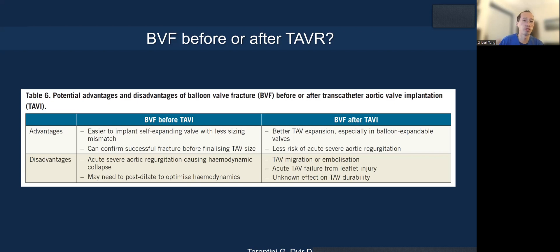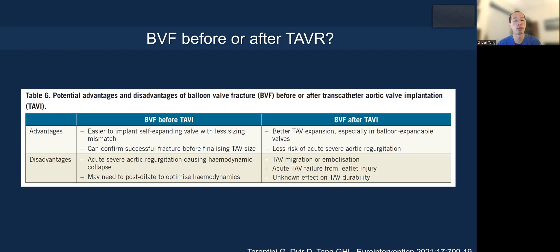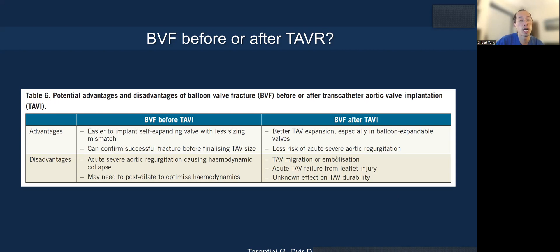There is still controversy around whether to fracture before or after TAVR. Fracturing pre makes it easier to implant a self-expanding valve with less sizing mismatch. However, early evidence suggests pre-fracture may not be as good hemodynamically as post-fracture. You can more easily confirm the fracture visually on fluoroscopy, but you can cause acute AI leading to hemodynamic collapse. Fracturing afterwards risks injuring the transcatheter valve leaflets, valve migration or embolization from a high implant, or undersizing relative to post-fracture frame dimensions.